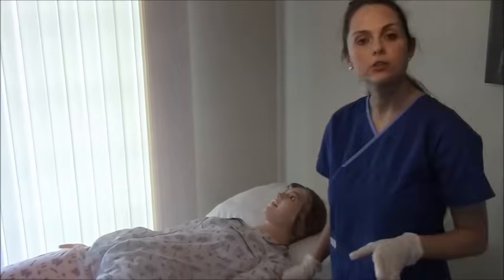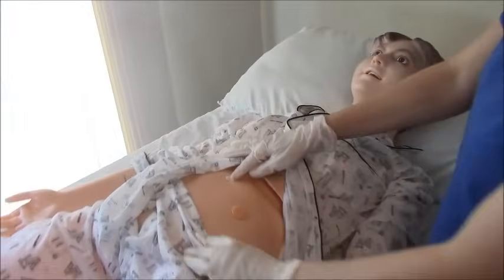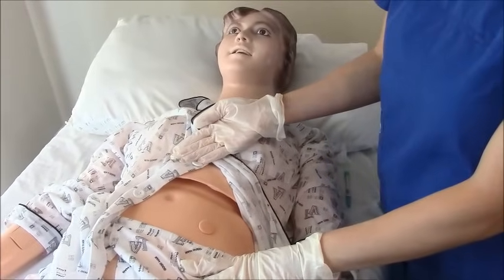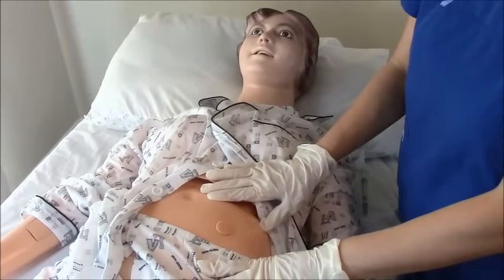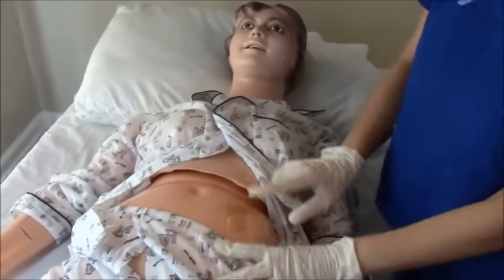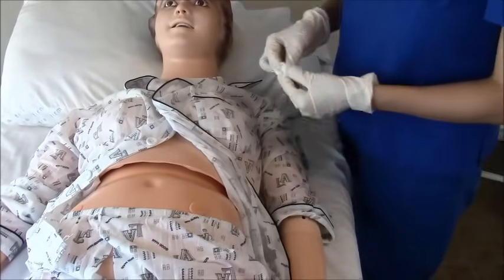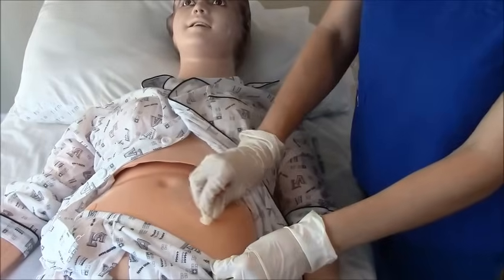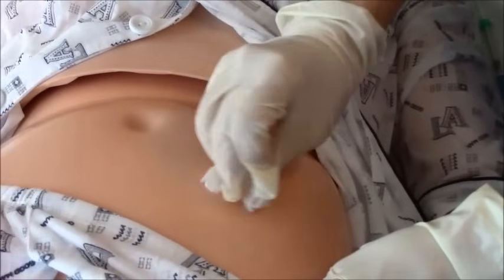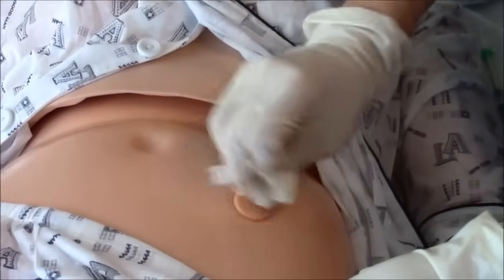Then, you're going to go to the abdomen and find the umbilical area. You'll want to go two inches away from the umbilical area. Ask the patient where the last time they gave the shot was, because you don't want to go in the same area. She told me they went over here last time, so this time we're going to go on this side — about two inches away from the umbilical area. We're going to clean the area for about three to five seconds with the alcohol prep in a nice circular motion, keeping it as clean as possible. This isn't a sterile procedure — you can use clean gloves.